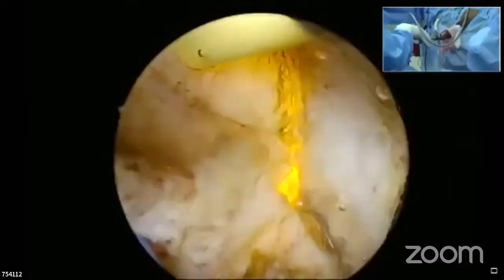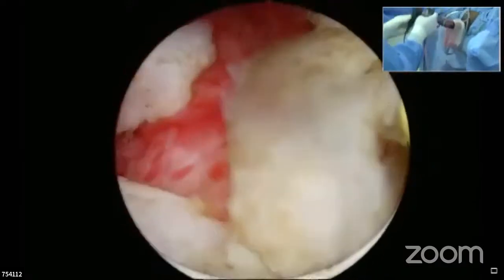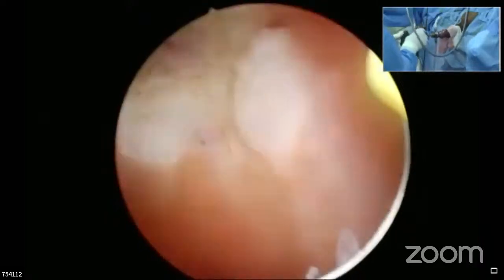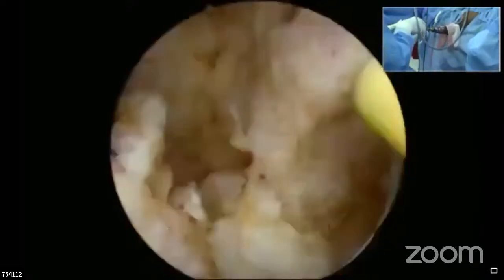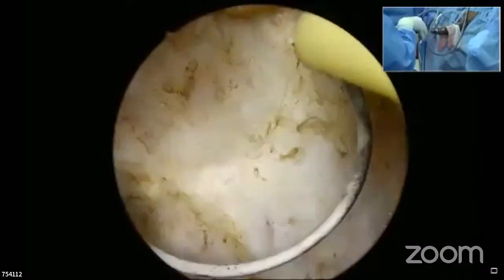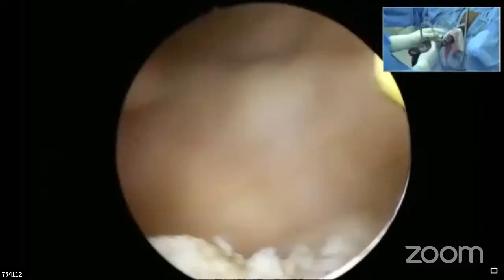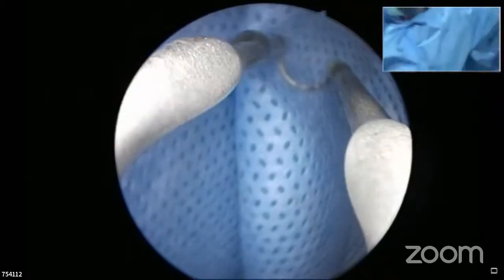What I'm saying is, if I get a large gland like this, considering the post-operative and operative morbidity, there is no harm if you can afford it. We should go for robotic simple prostatectomy, doing the same job as open enucleation of the prostate. I'm surprised to see the literature: since 2012 they have been doing this procedure, and more than 3,000-4,000 cases have been done all over the world. Possibly in the near future it will be the answer for many patients like this. I don't deny that fact.